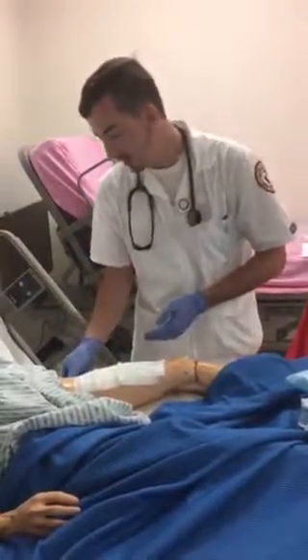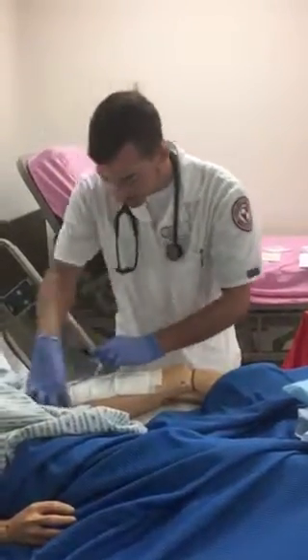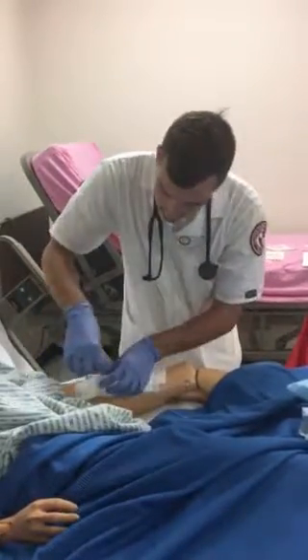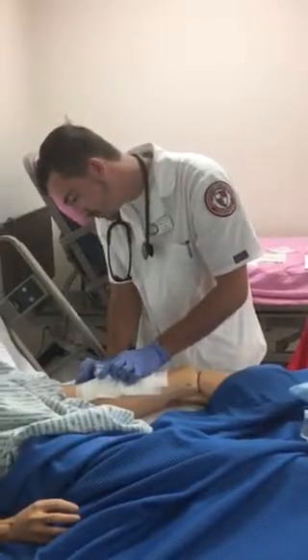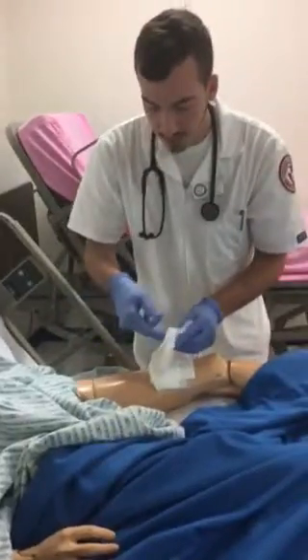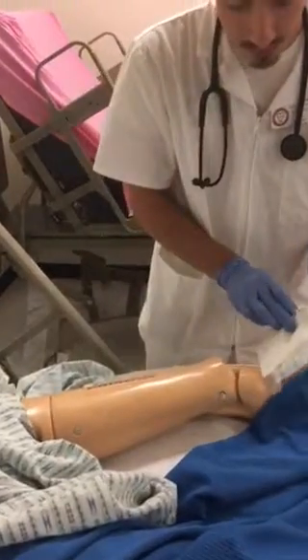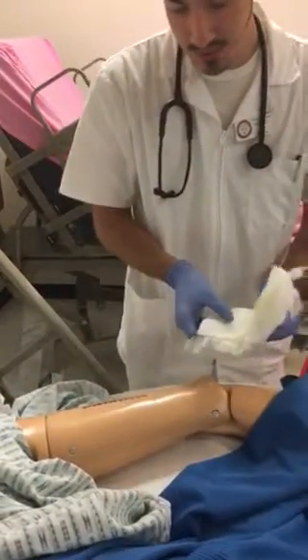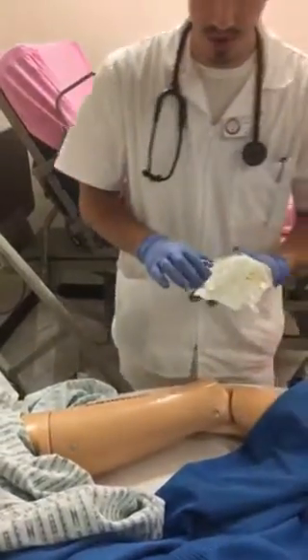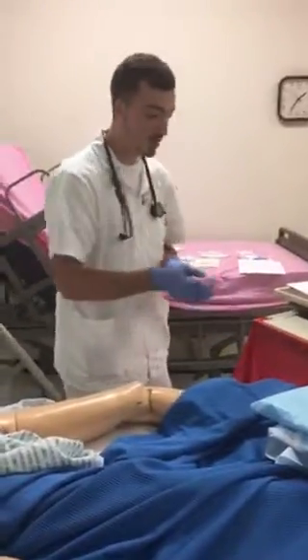So I'm going to go ahead and very carefully remove the old dressing. And while I'm doing this, I'm checking on first the amount of drainage and the quality of drainage on the pads that I'm removing. And I'm also checking the incision for signs of infection, such as inflammation and redness, swelling, making sure that there's no signs of dehiscence. So I'm going to go ahead and discard this old dressing in a biohazard bag.